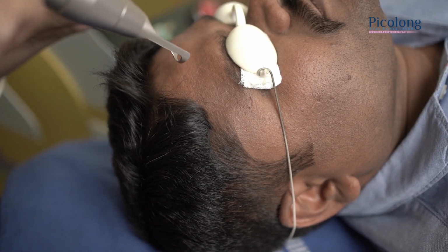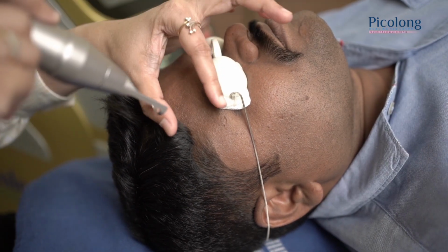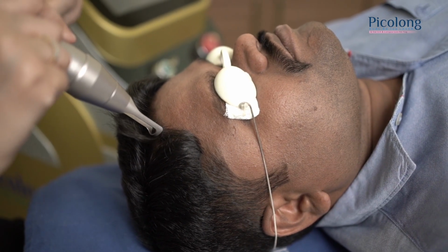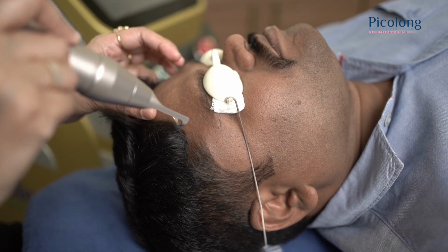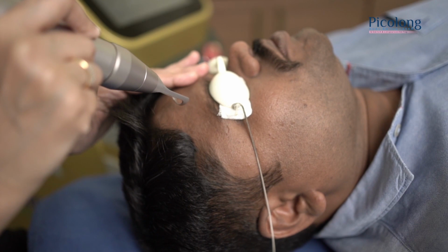You cover the patient's eyes properly, as well as you wear the protective goggles. So as you can see, he has a hyperpigmented forehead, for which I am using 240 millijoules with a spot size of 5 mm. So hereby I am starting the laser. Are you okay? Shall I start the procedure? Sure.